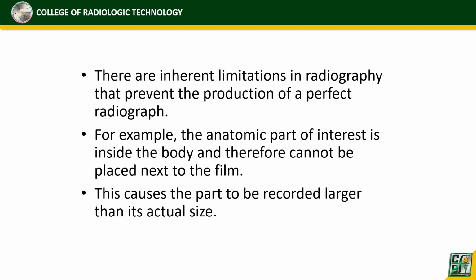Yung definitions naman, of course there are certain factors that we need to consider in order for us to produce a good quality radiograph. So ano yung mga inherent limitation? When we say inherent, di ba, nandun na yon, given na yon, wala tayong magawa na ma-eliminate yon. Instead, ang pwede lang natin gawin is to either reduce or to avoid. So example nito yung mga anatomic part of interest which is inside the body, and therefore cannot be placed next to the film.